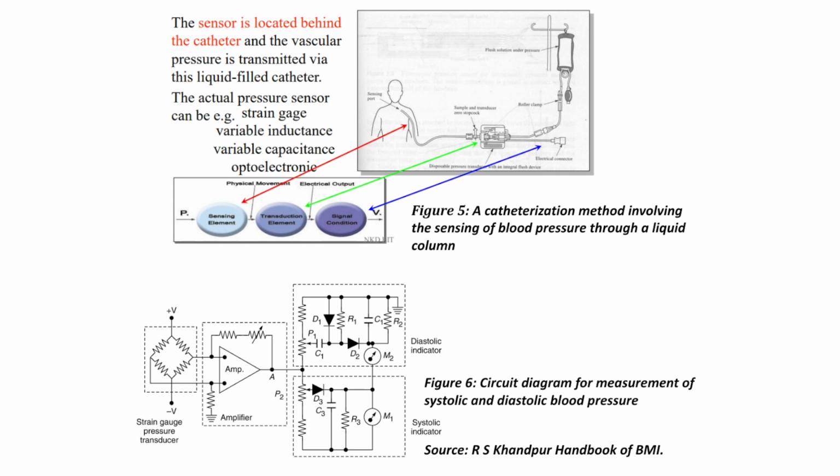A clamping circuit consisting of capacitor C1 and diode D1 is used to develop a voltage equal to the peak to peak value of the pulse pressure. This voltage appears across resistor R1. Diode D2 would then conduct and charge capacitor C2 to the peak value of the pulse signal.